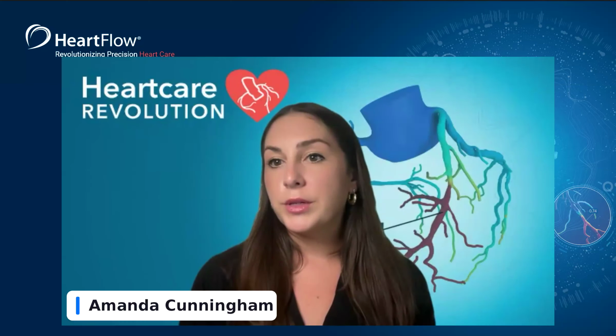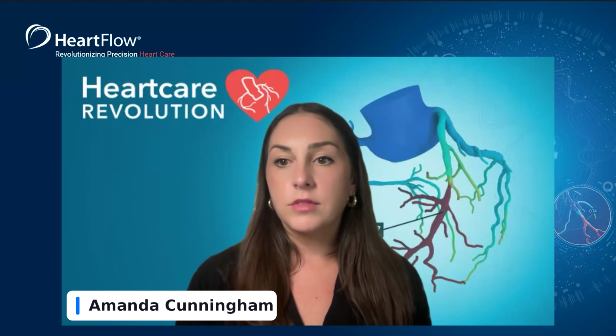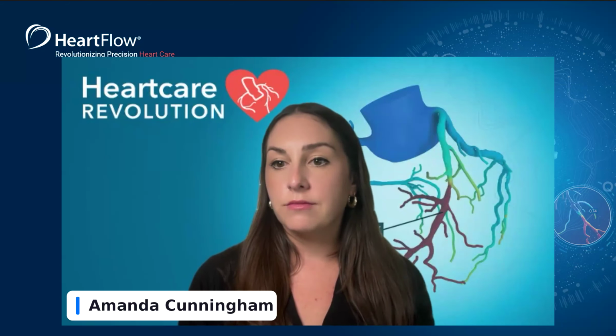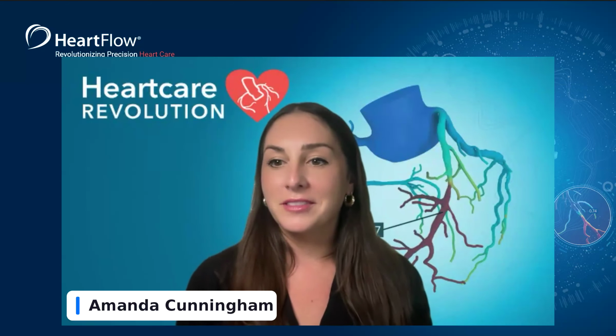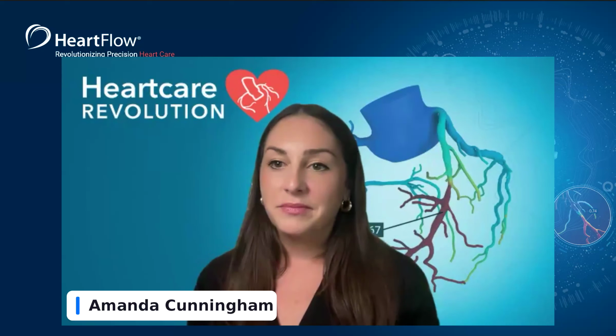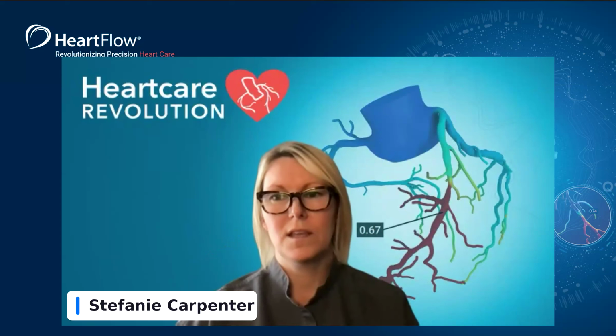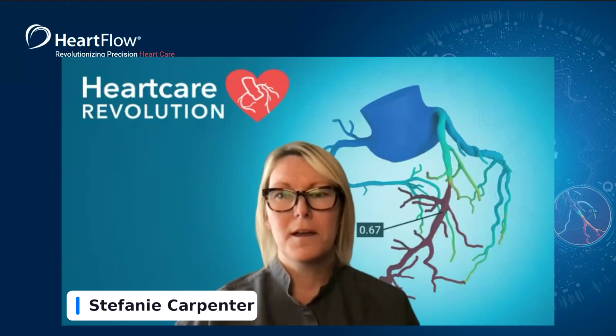I would say probably just doing the research, and HeartFlow's done tons of trials and studies, and I would say just digging into those and going through them. They're helpful. I would say the first thing that I always talk about is the ACC and the AHA chest pain guidelines, and how coronary CTA with FFR was elevated and is a frontline test.